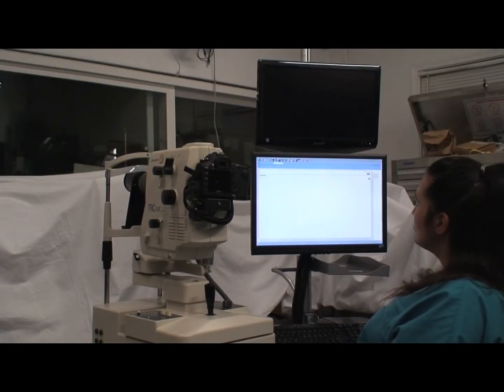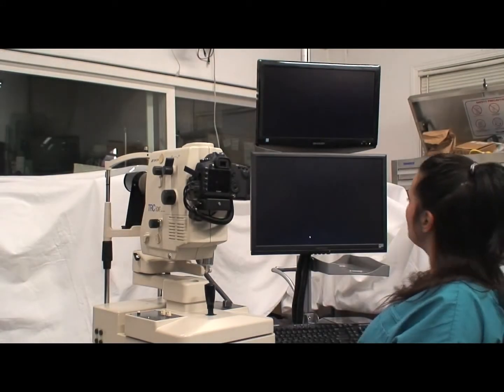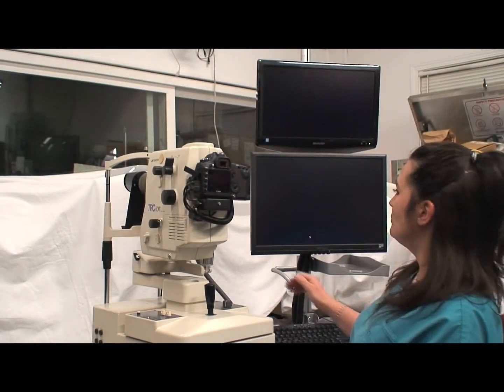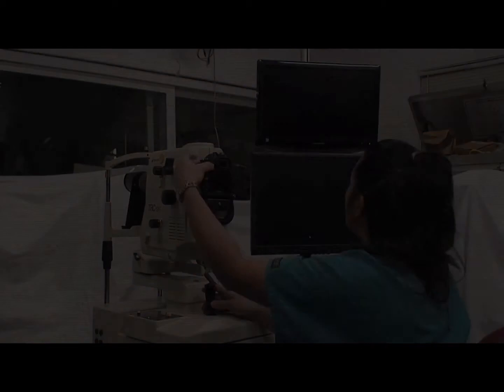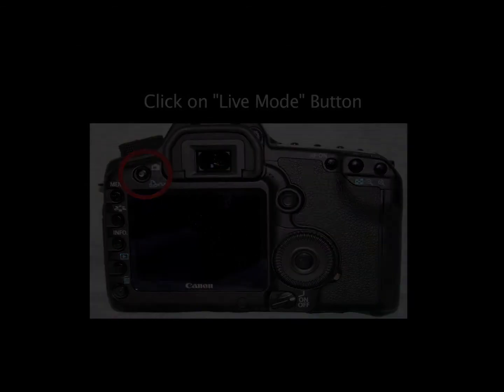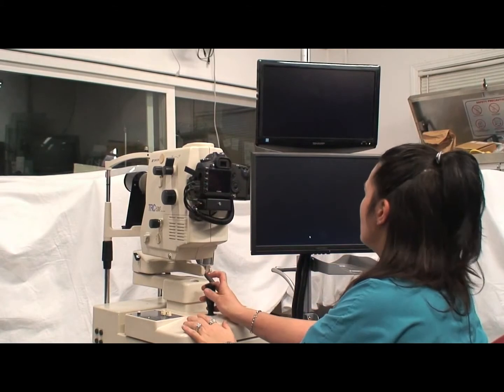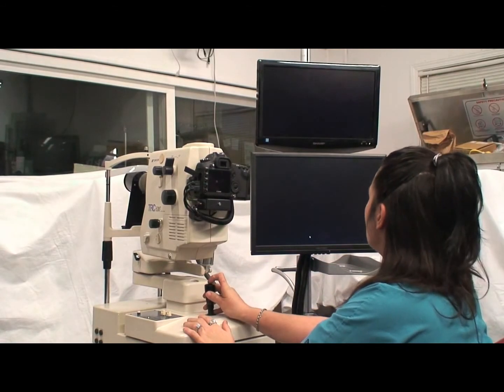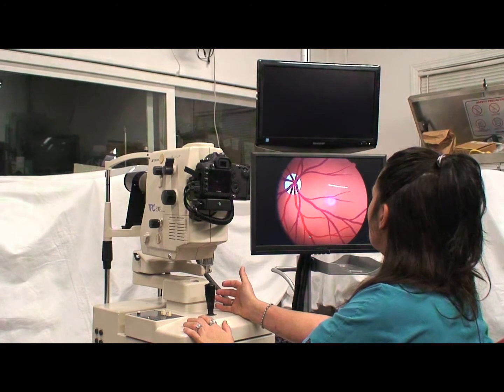Now click on the digital camera icon to go into capture mode. If you have a live video system, click on the live mode button on the Canon 5D Mark II. Fire the joystick on the retinal camera once to start the live mode.